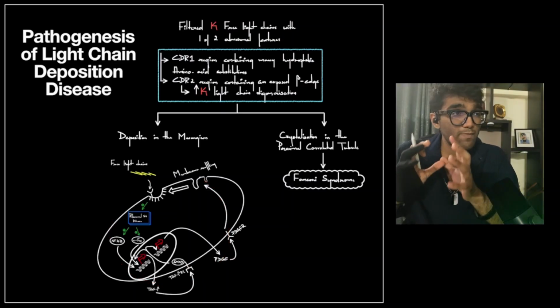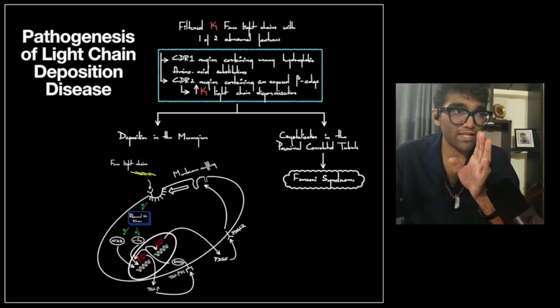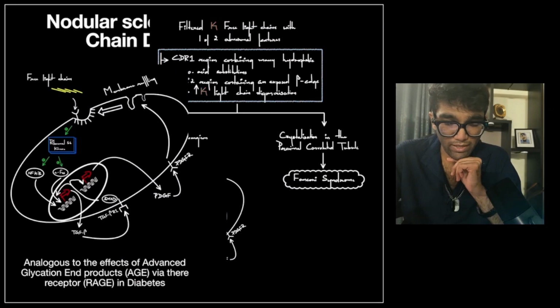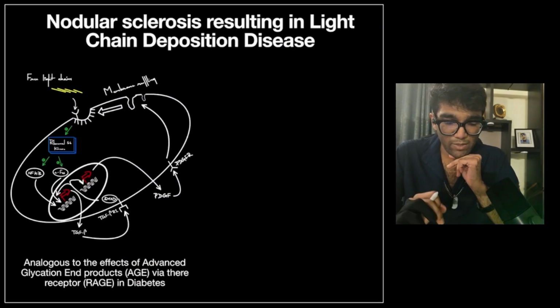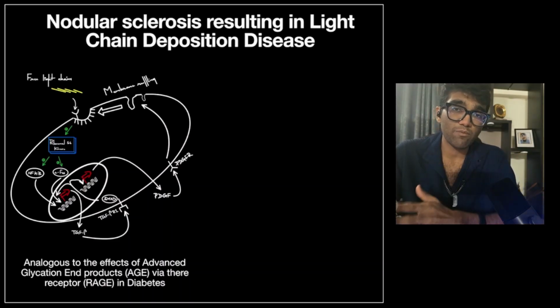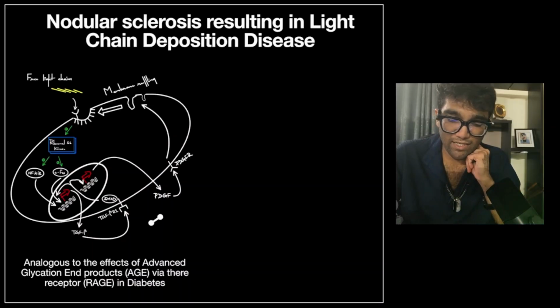So this is a very specific morphology that you see. It only happens here, and it happens in diabetic kidney disease. So why could that happen? Why would there be this kind of morphological overlap? So as you can see, the same entire process is happening. This is extremely analogous to the type of signaling that is induced by advanced glycation end products in patients who have very high blood glucose levels. Okay. And that happens in diabetes.